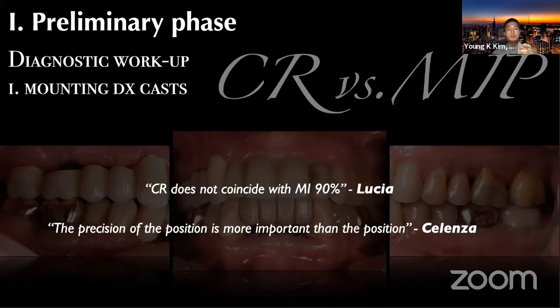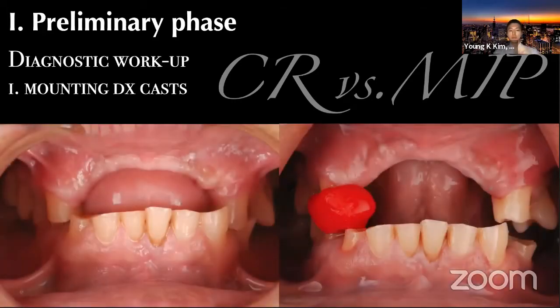If the patient has a severe deflective occlusion or interferences, and we're rehabilitating more than 3 or 4 units as a bridge or multi-unit restorations or even full mouth, then I would like to reference with a CR to capture the bite, because that's the most repeatable, most comfortable position for the patient, so that we can minimize any potential deterioration in the future. So same case over here, when the patient presented with a completely collapsed vertical, I used a Lucia jig technique here.